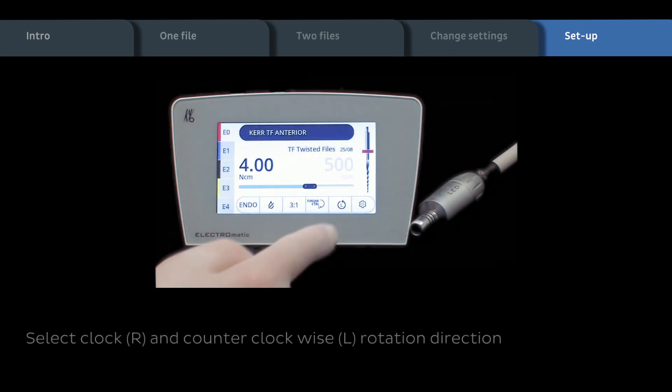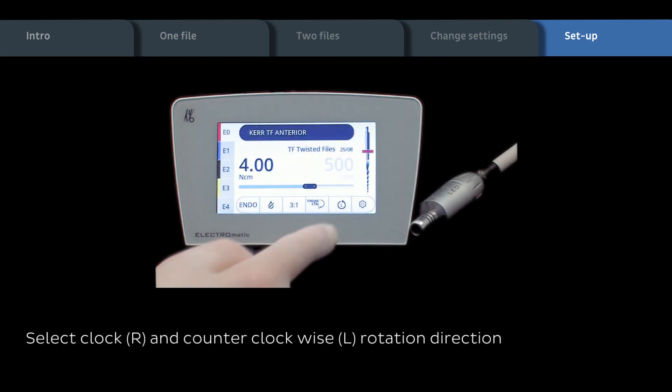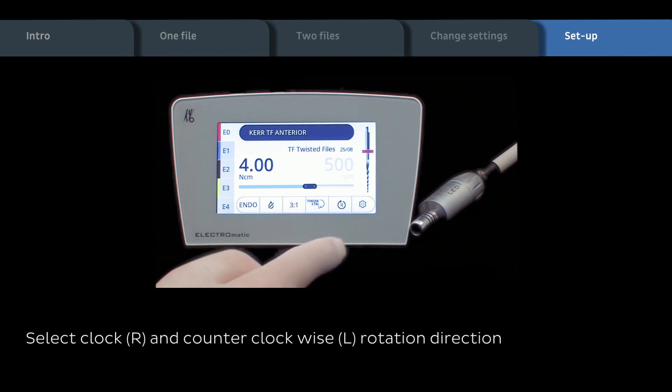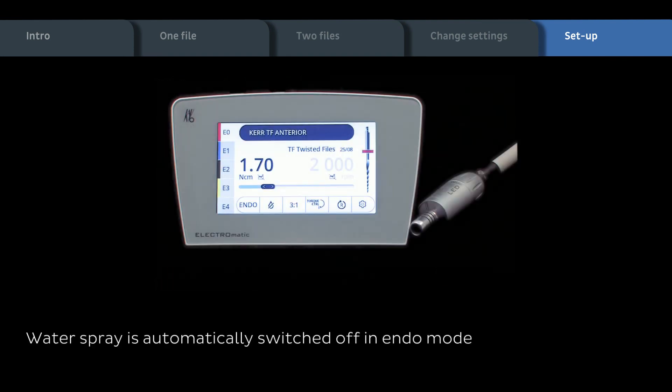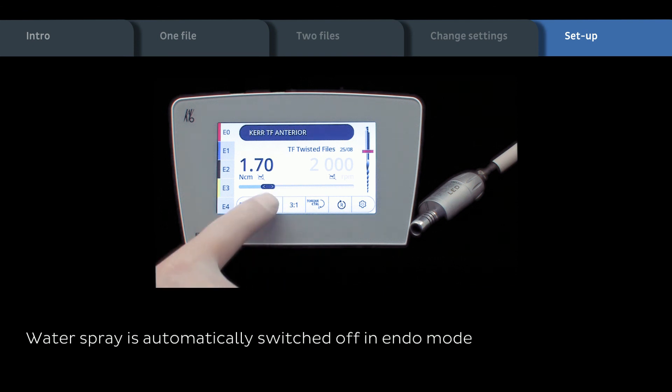We show you now how the clockwise and counterclockwise rotation direction can be selected. Water spray is automatically switched off in endo mode. Spray can get reactivated.